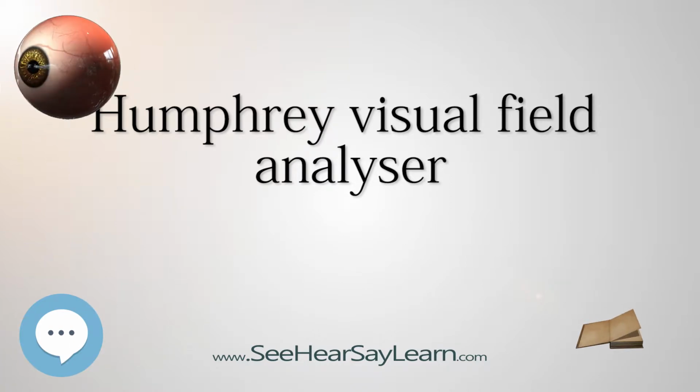Method of assessment. The analyzer test takes approximately 5-8 minutes, excluding patient setup. There are multiple steps which need to be done before commencement of the test to ensure reliable results are attained. The test type and eye are firstly selected and the patient's details are entered, including their refractive error. The analyzer will provide a lens strength and type, either spherical and/or cylindrical, if required for the test.